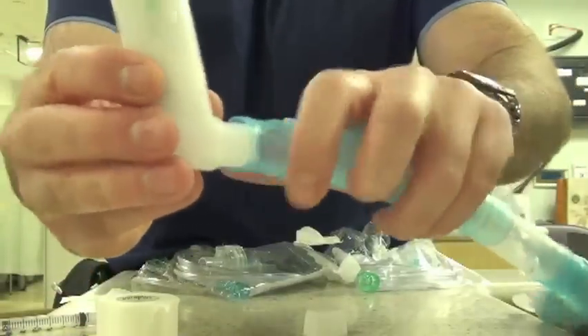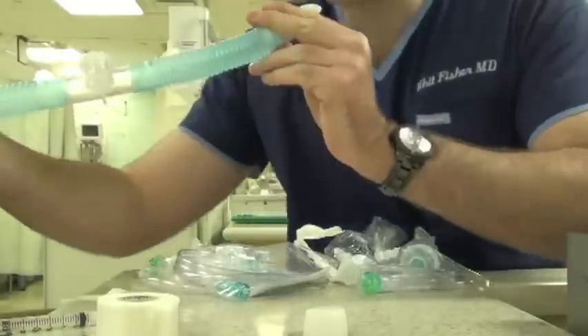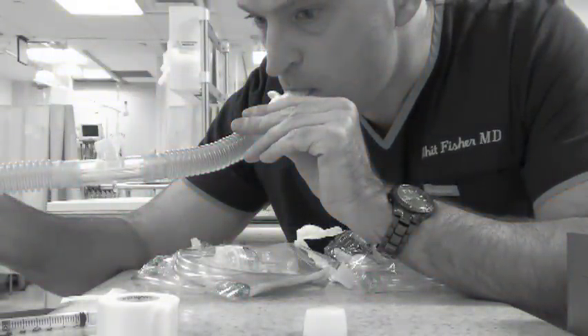Stuff the Albuterol inhaler into one end and spray two puffs in and then inhale as shown. I got a nice Albuterol buzz off this one, so I know it works.